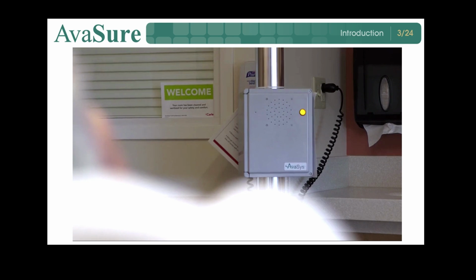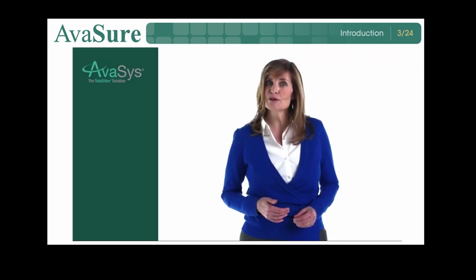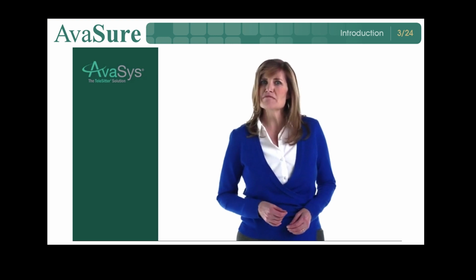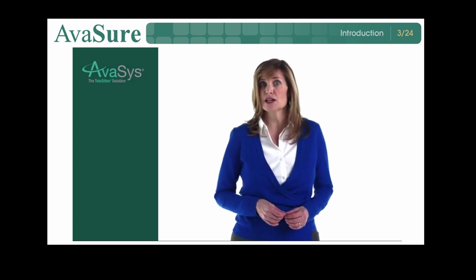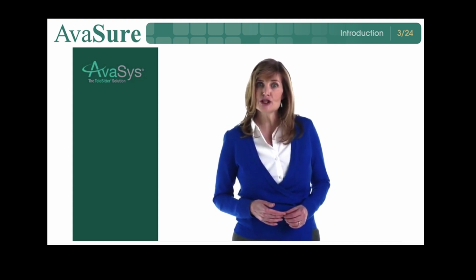The audio component allows for two-way communication between the observer and the patient when immediate communication is needed to redirect a patient for safety or to check in on the patient when needed.